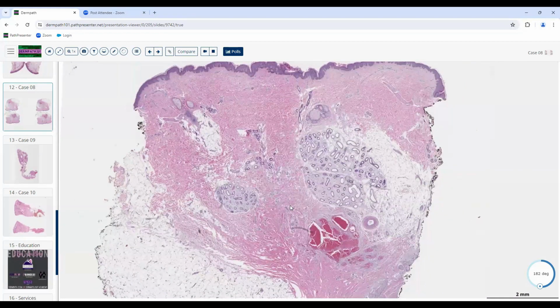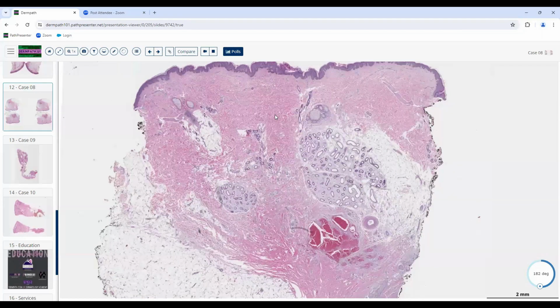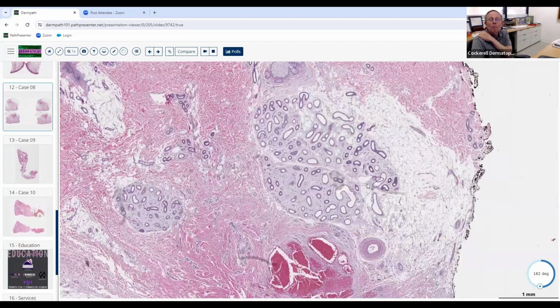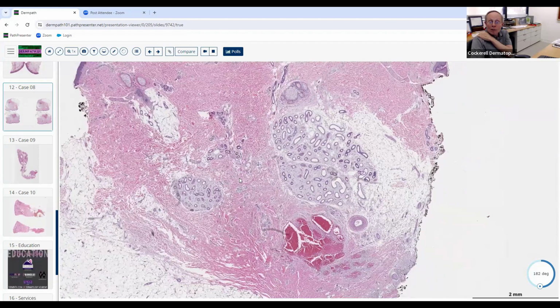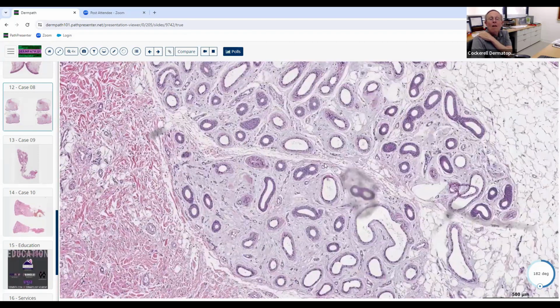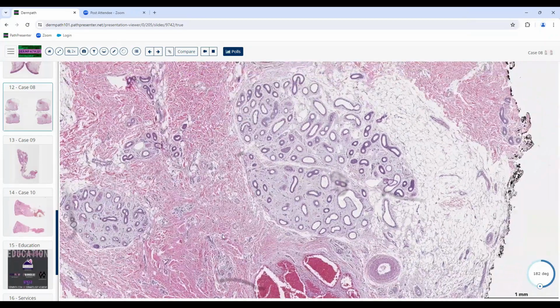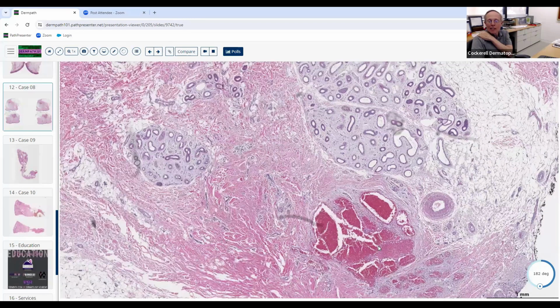And so, is this epithelial or non-epithelial, an inflammatory or neoplastic process? What do you think's going on here? It looks neoplastic. Yeah, or maybe if it's not really a true neoplasm, sometimes we have a term for that. What do you think that might be? Like a hamartoma. Yeah, good. Are you aware of any hamartoma that might look like this? Maybe, given that there's eccrine appearance and an angiomatous appearance. Eccrine angiomatous hyperplasia or hamartoma. Good, excellent. That's what it is.